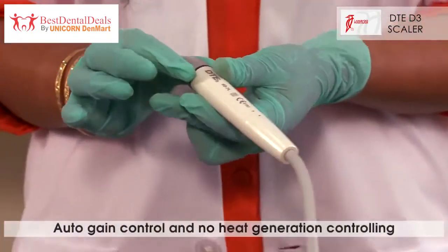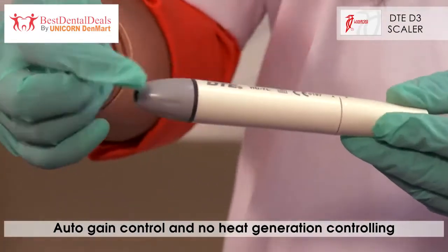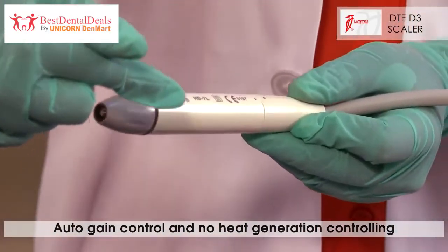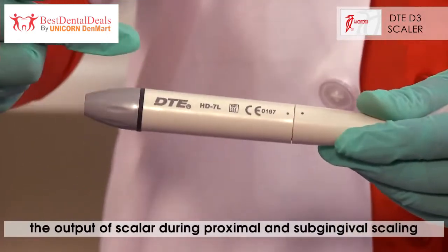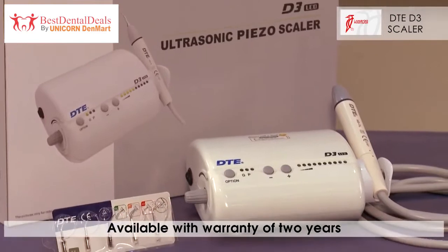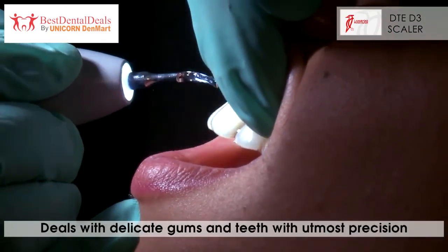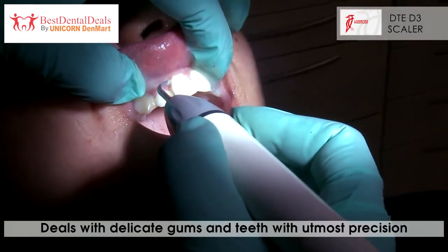This handpiece has a unique feature of auto gain control and no heat generation, controlling the output of the scaler while doing proximal and sub-gingival scaling. Coming with a warranty of 2 years, these scalers allow the delicate gums and teeth to be dealt with utmost precision.